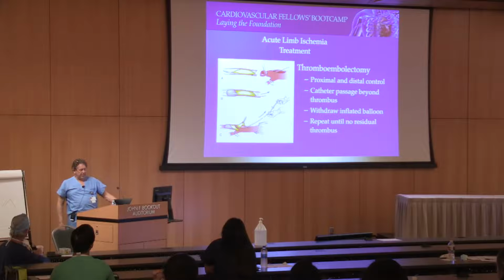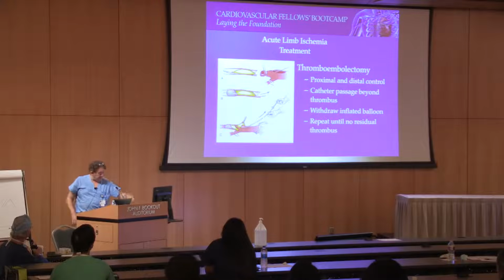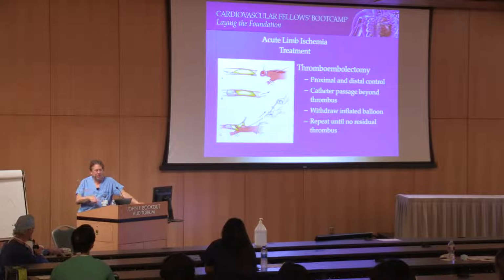So one of the things that I noticed, I'm going to try and get this up in the lab. Actually, I'm talking to Becca, see if we've got them up there, is the use of a Fogarty catheter. We probably need to incorporate exposing the Fogarty catheters in this course. This is probably the single most effective way of moving clot that's ever been invented. And it's worthwhile telling Fogarty. So he stood at this podium probably a year and a half ago.